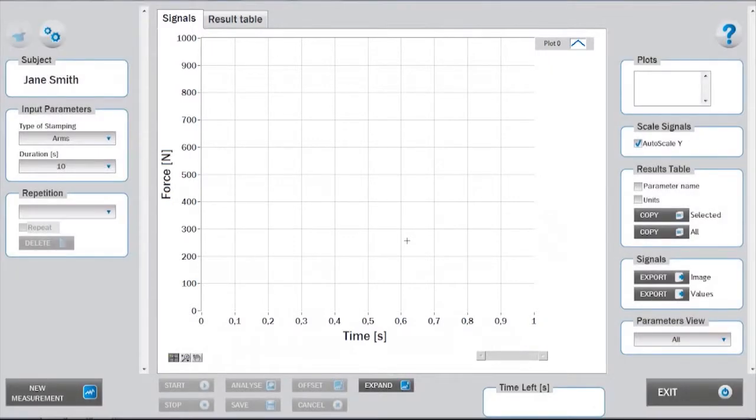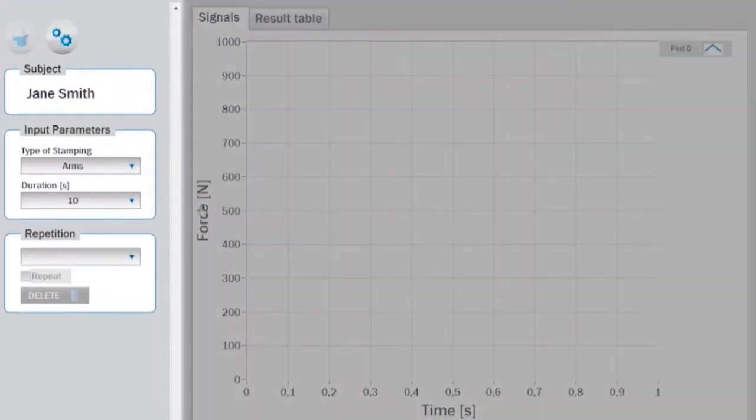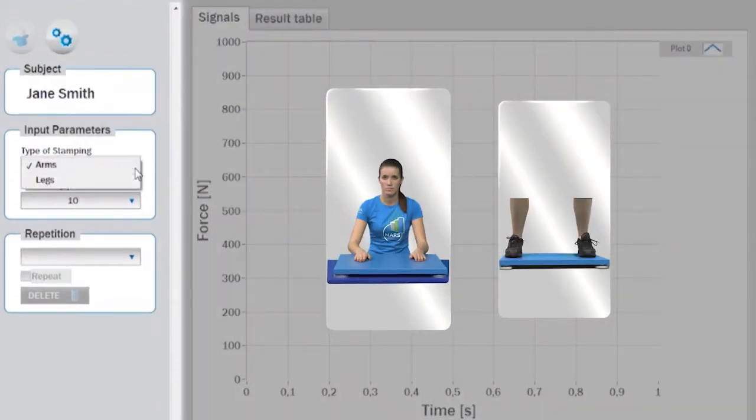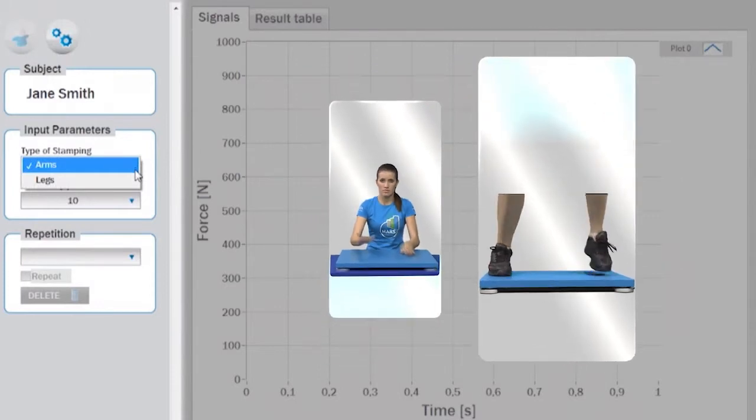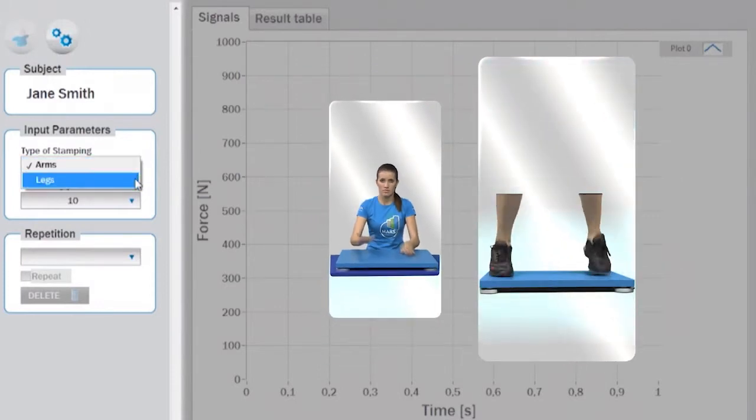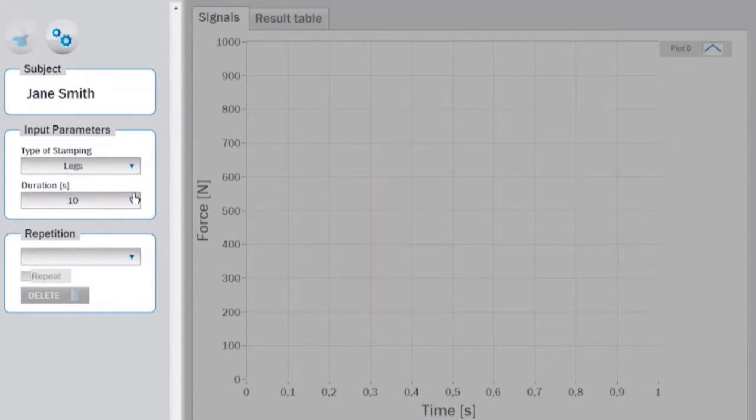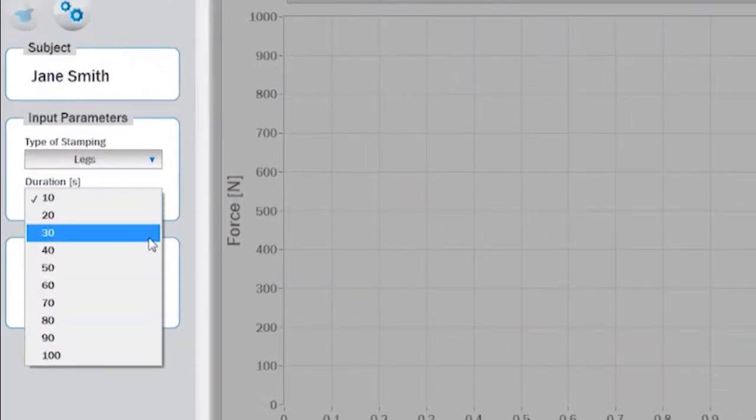Before starting the measurement, appropriate input parameters must be determined in the setup panel. These are type of stamping, where you can choose between arms or legs, and duration, which is defined in seconds.